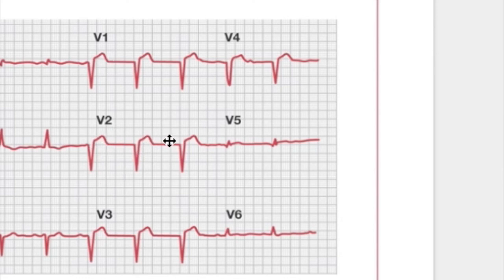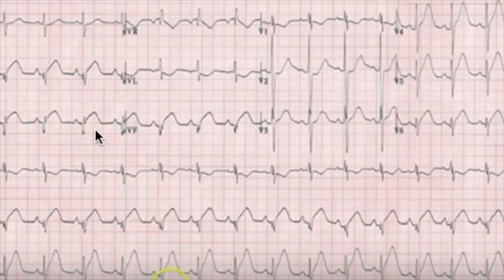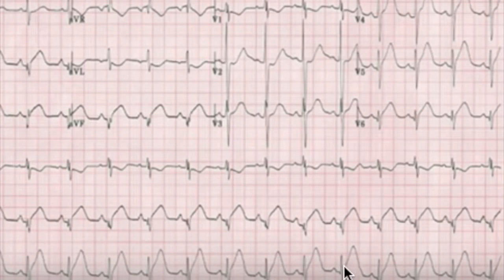On another ECG example, Q waves with ST elevation in leads II, III, and aVF indicate an acute inferior MI. However, a downward deflection after the R wave is by definition an S wave, not a Q wave — as the Q wave must occur before the R wave in the QRS complex.